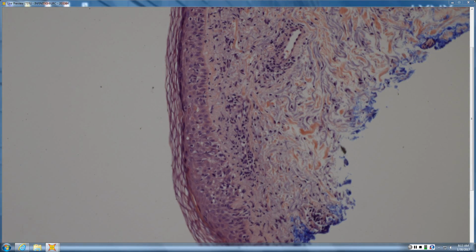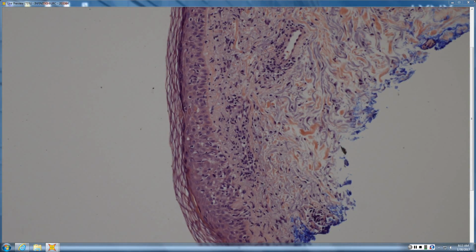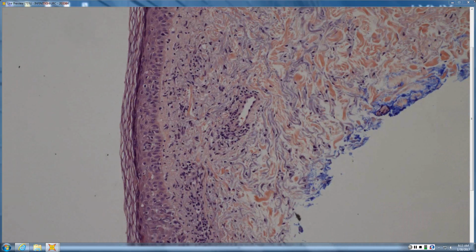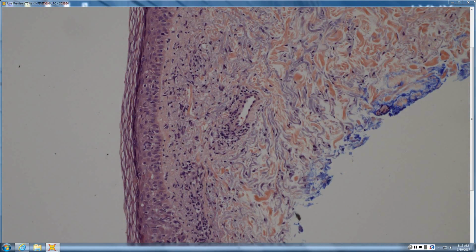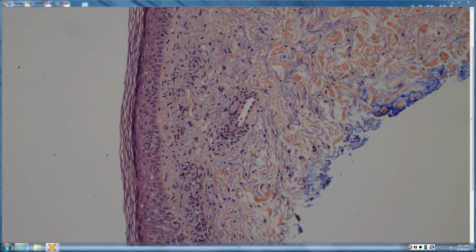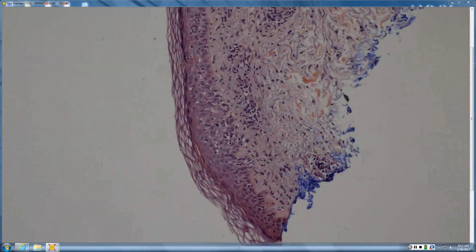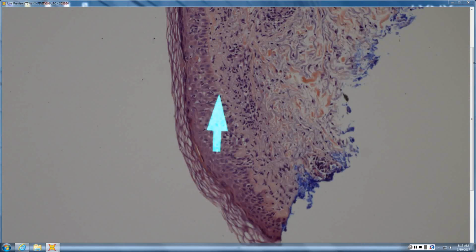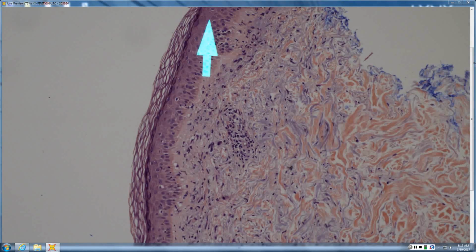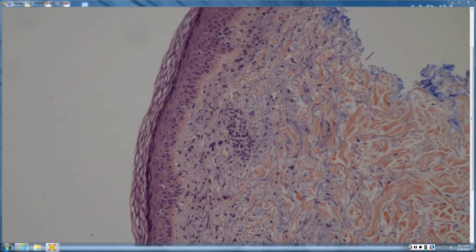It's like a superficial perivascular and interstitial infiltrate. Mucin or just some solar elastosis in the dermis as well? Yeah, probably solar elastosis, because you can really see that they're elastic fibers. See, the rete pattern is kind of effaced a little bit. And then it's not quite interface dermatitis, but I think with syphilis there's definitely a little interface there. It's kind of spongiotic, but it's interface, but no, it's spongiotic, but no, it's interface.